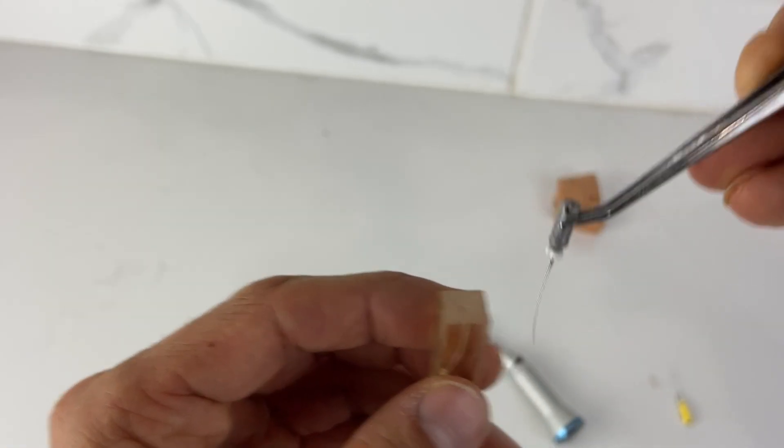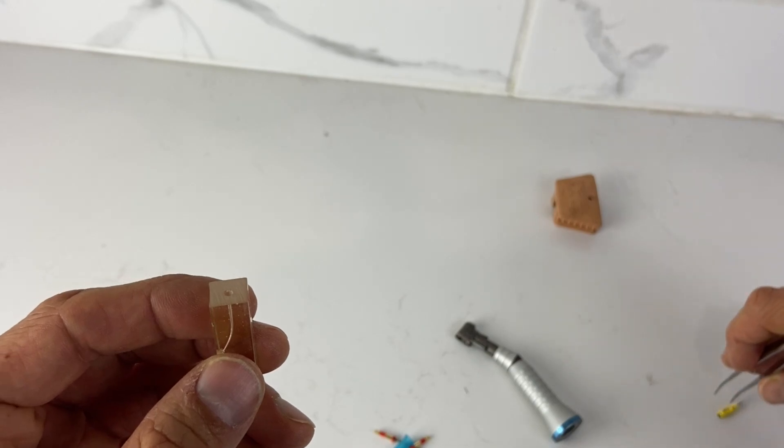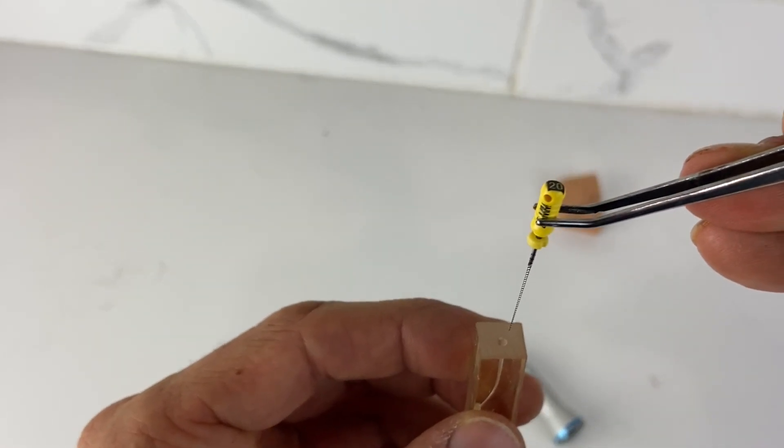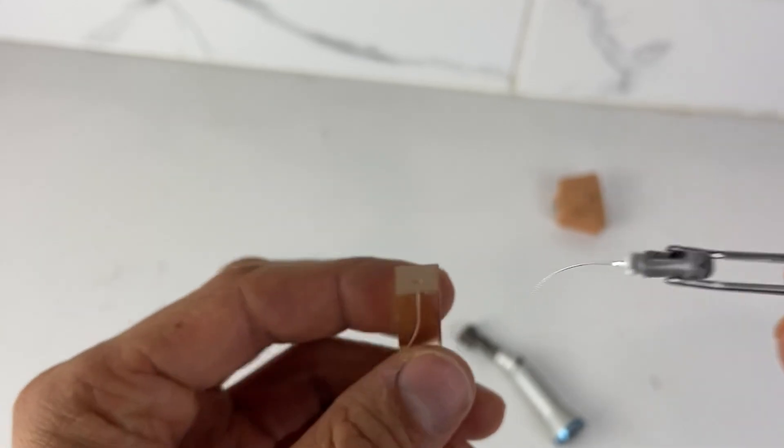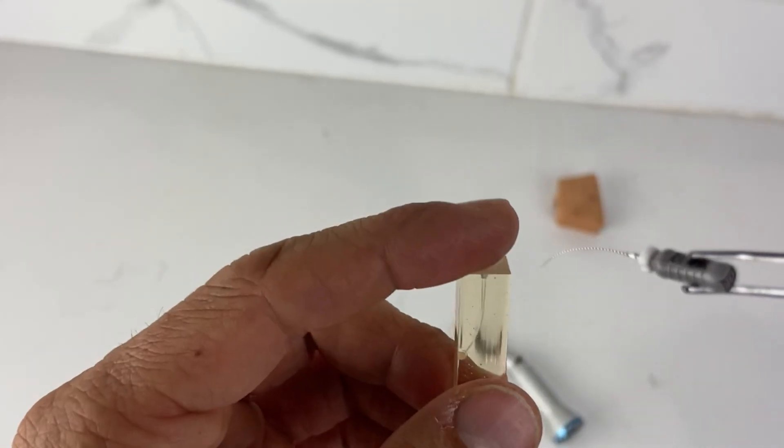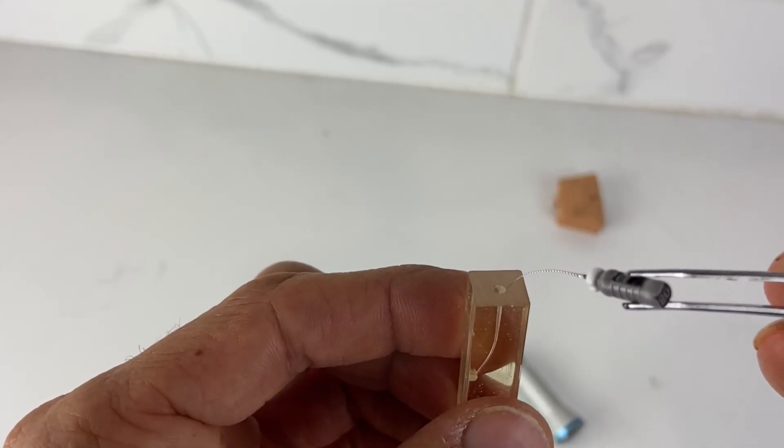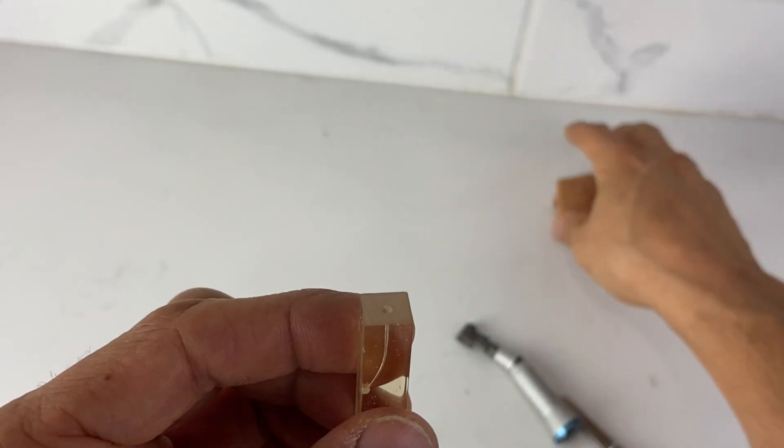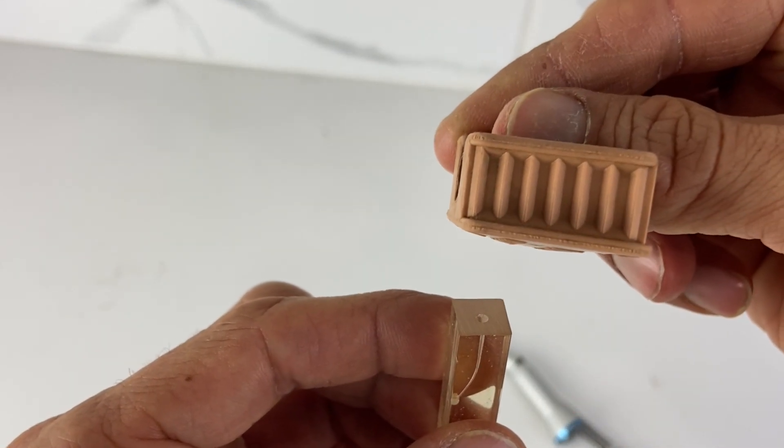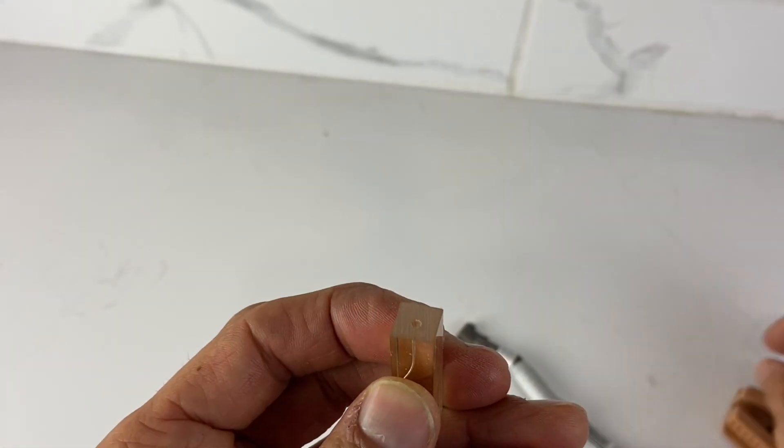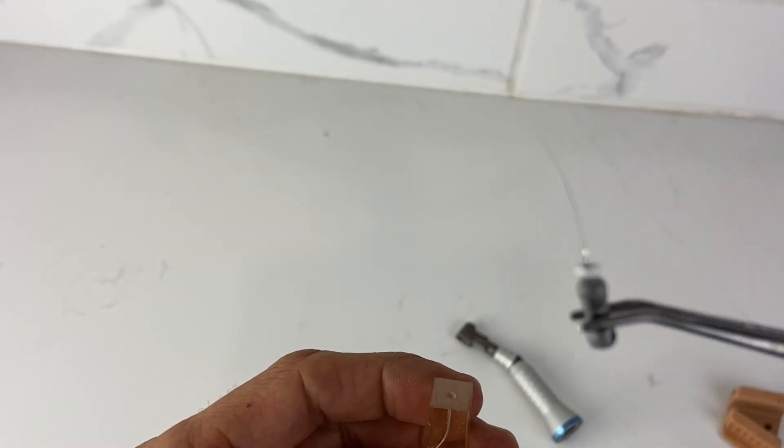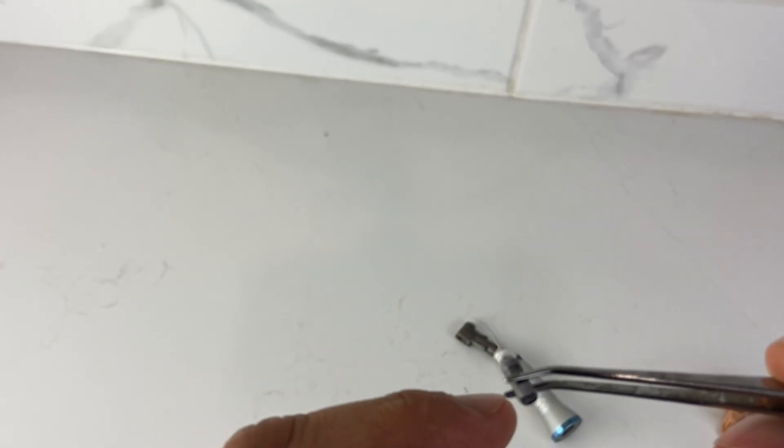You're trying to weasel it and try to sneak it into that little spot with that curve. And the file's not standing straight up. Like normally what you would have to do in that situation, the file would have to be standing straight up and down to get it in there. But when you've got that banana curve and the banana curve is very gentle.